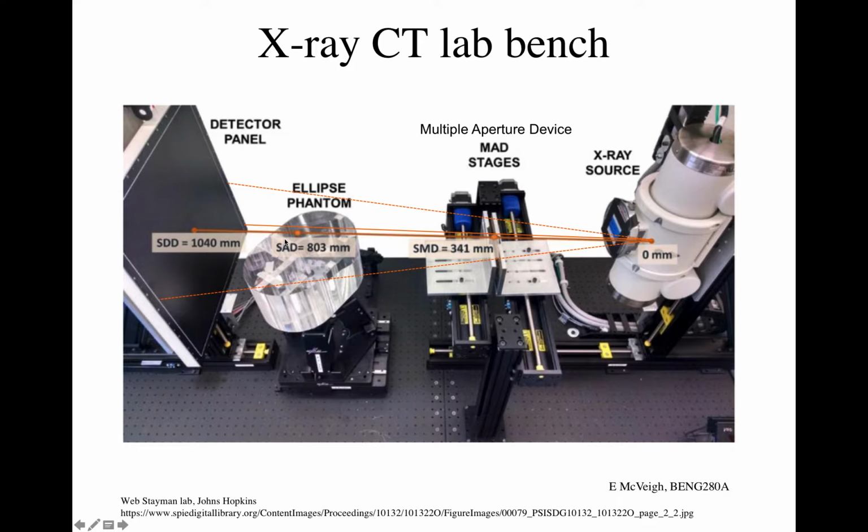And just like the Hounsfield experiment, what you do is you rotate the phantom, right? So you have absolute control of rotating that phantom. And you create the X-ray image that way. And so a lot of X-ray imaging laboratories across the country, they have setups like this. Right? Can you talk more about that?